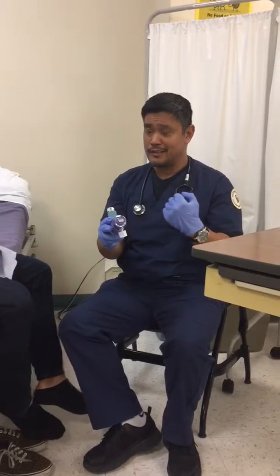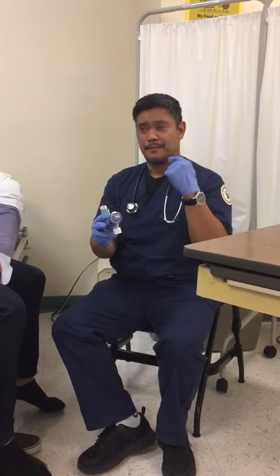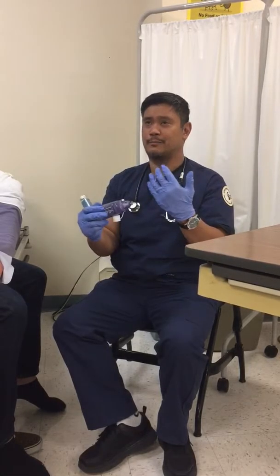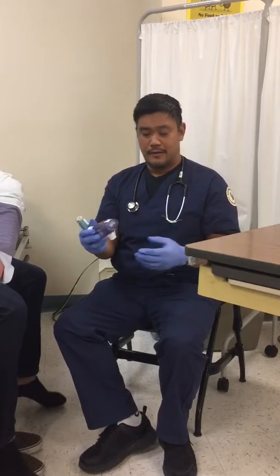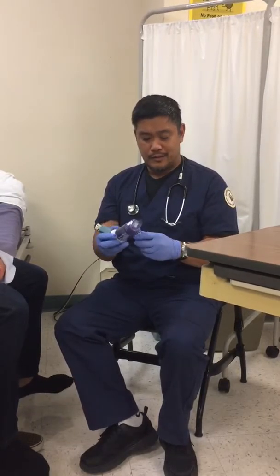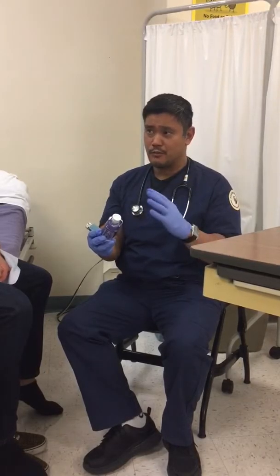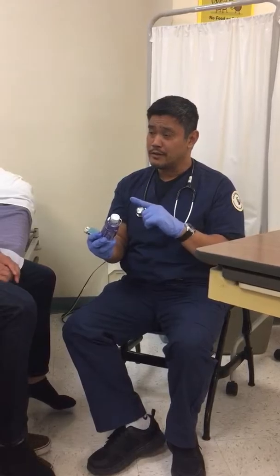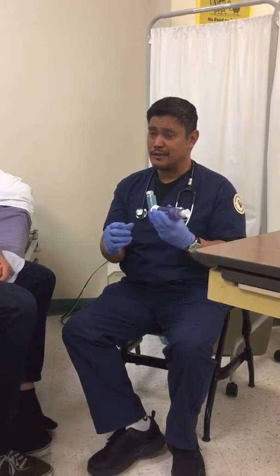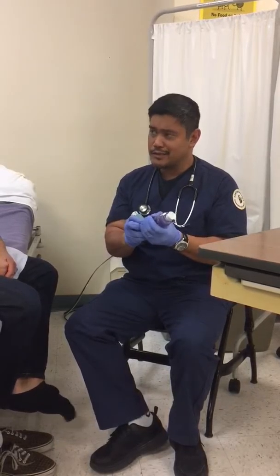Once you've completely inhaled everything, go ahead and hold your breath for about 10 seconds, and then breathe out through your nose. It helps deposit the medication a little bit further down into your lungs where it needs to go. The medication is usually 2 puffs, so you're going to want to wait about a minute between puffs. The medication usually lasts about 4 hours. But it's a rescue medication, so you're going to be using this as needed.